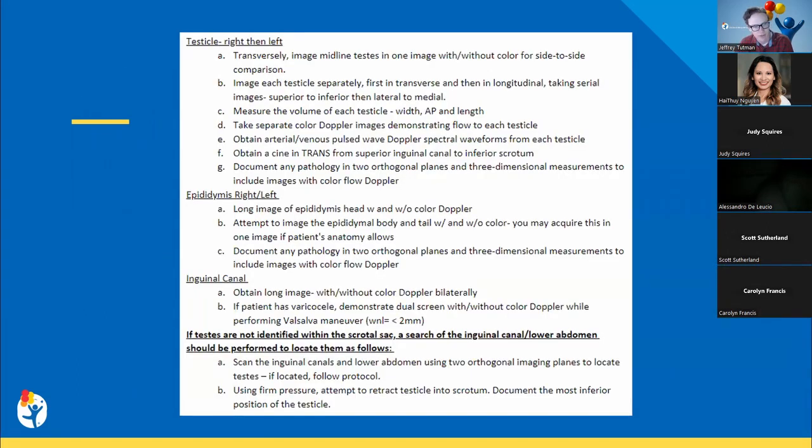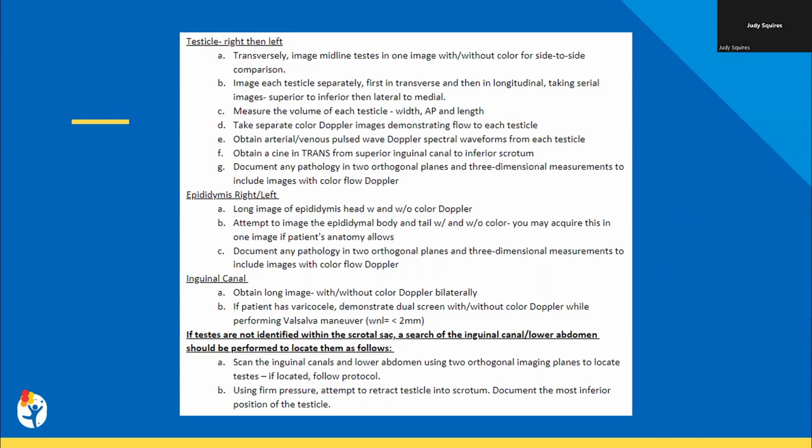This is just to share with you our scan protocol, so that you all have it. This will be permanently available on our YouTube page, and everybody has full access to it. If anybody's interested, I'm happy to send it out as well. I think this is relatively standard.